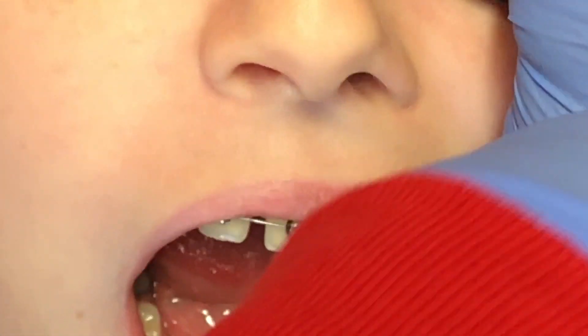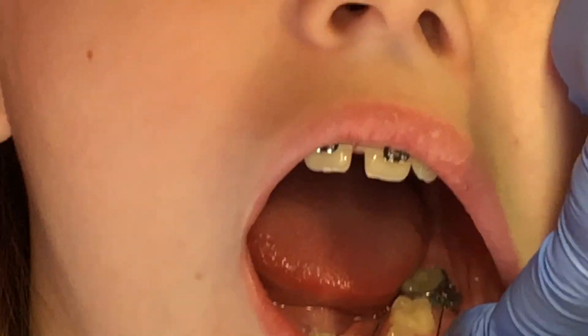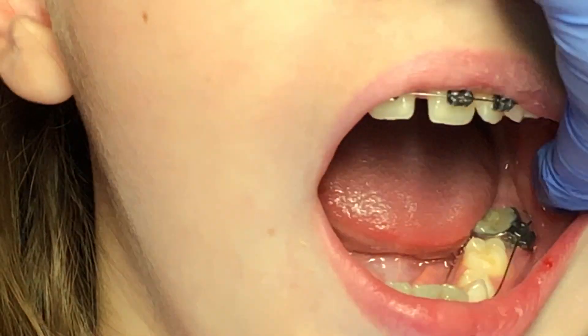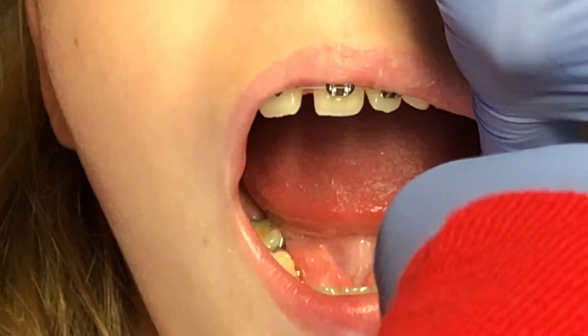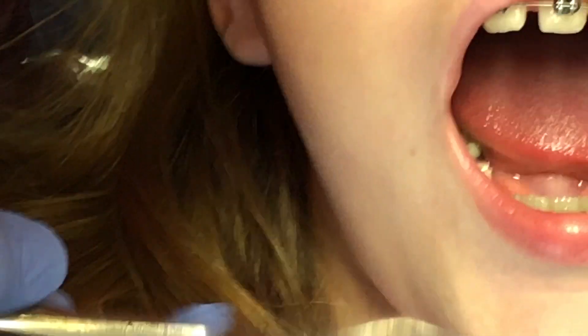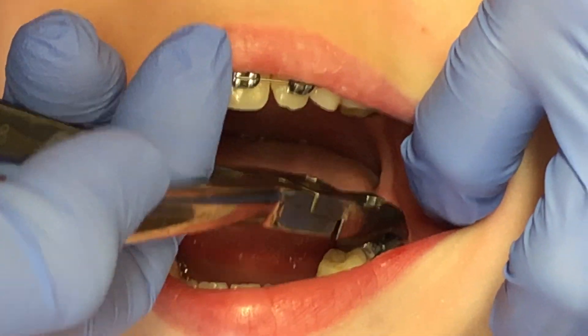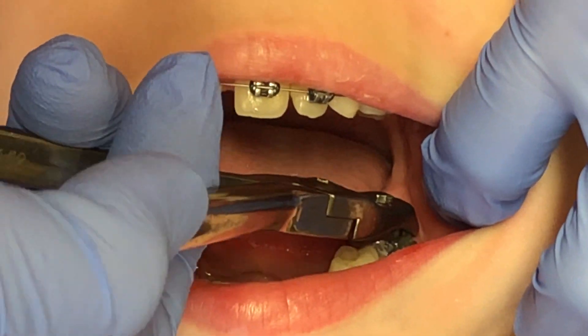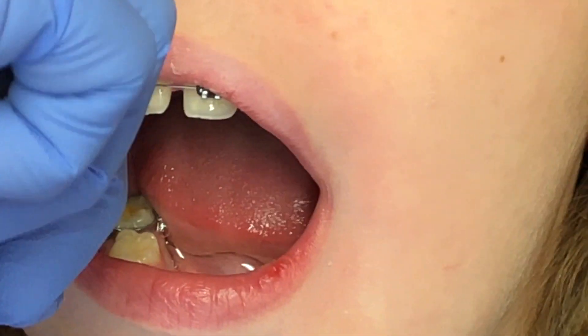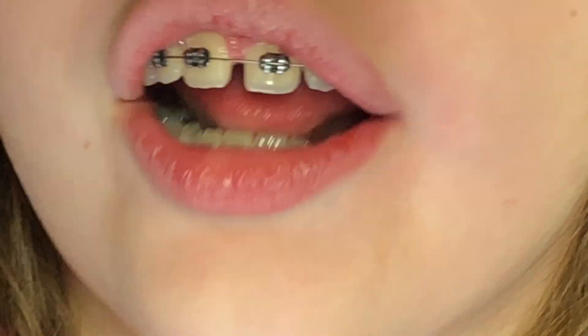Open big. I'm just going to give it one more turn. The more we can have it turn, the less likely it'll come out. Turn towards me — good. You're turning it on the end. All right, hopefully that'll do the trick.